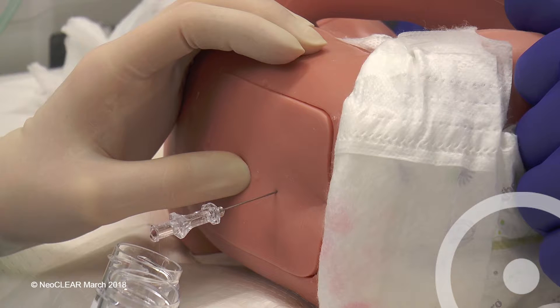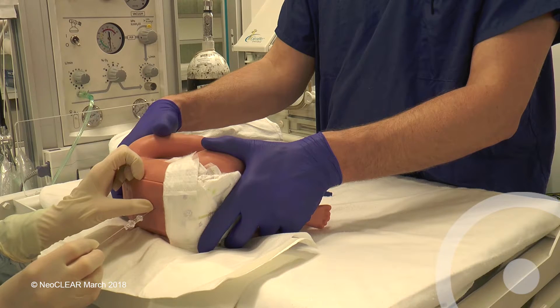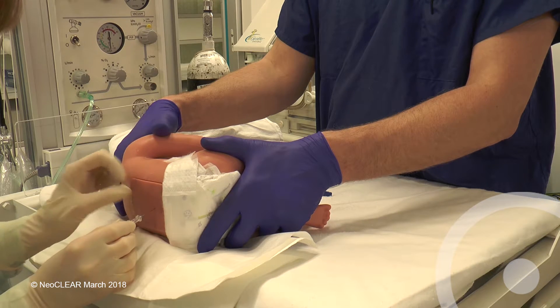Aim to collect into each sterile pot five drops in a preterm baby and eight drops in a term baby. Replace the stylet, remove the needle, and apply sterile gauze.